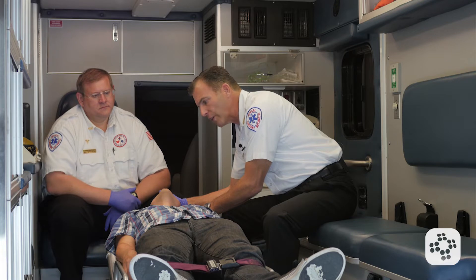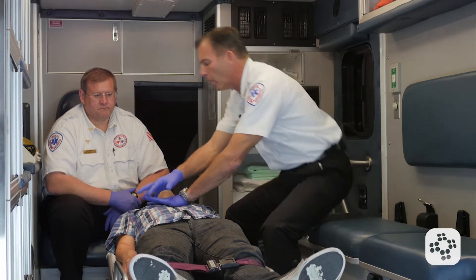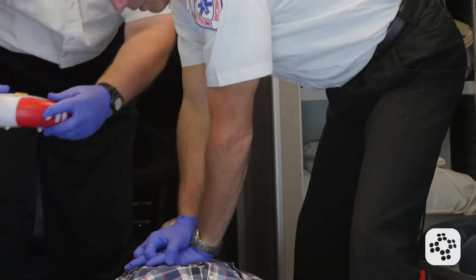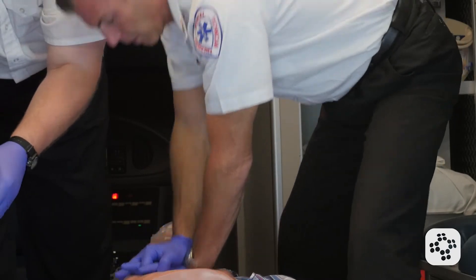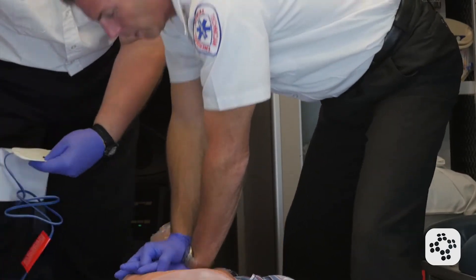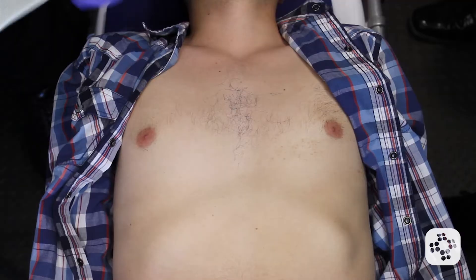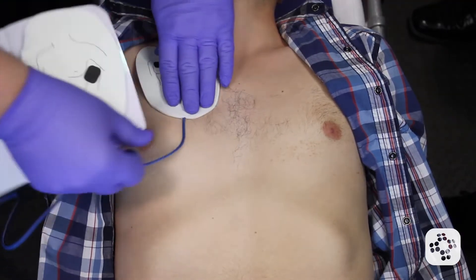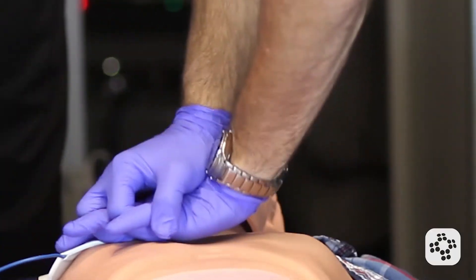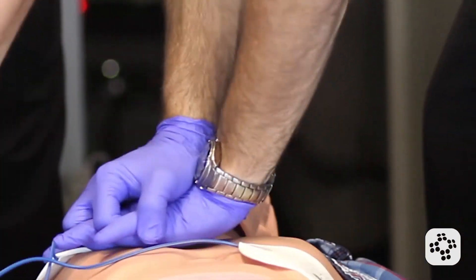Now we're going to assess this person for normal breathing and a carotid pulse. I checked for no more than 10 seconds. The patient is not breathing and they do not have a pulse. I'm going into CPR now. I stopped only long enough for my partner to put that pad on, and then I'm right back onto my compressions. Continuous chest compressions until we get the AED set up.